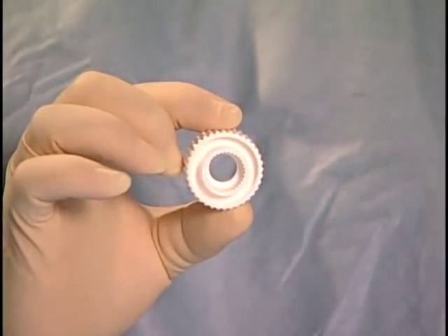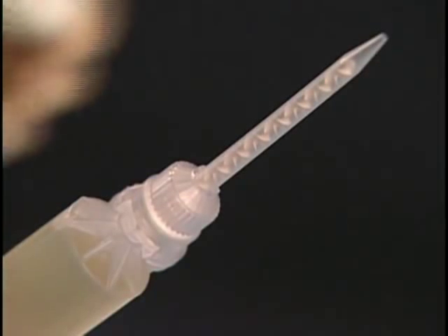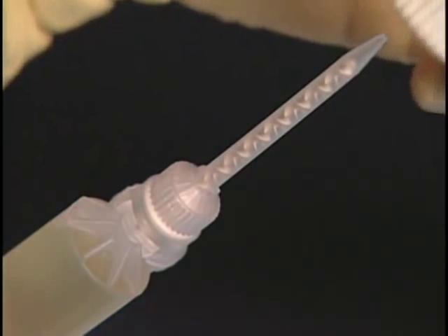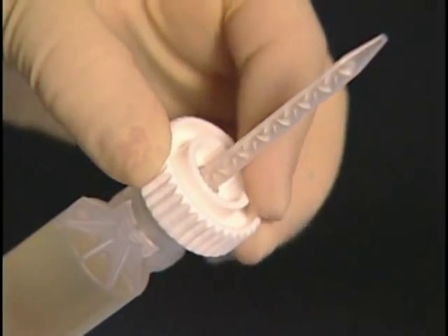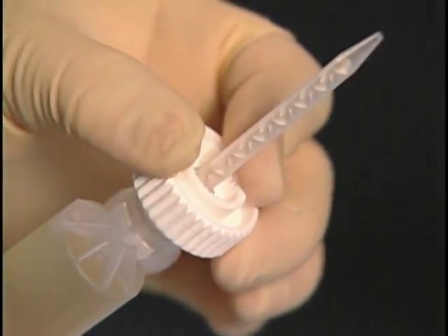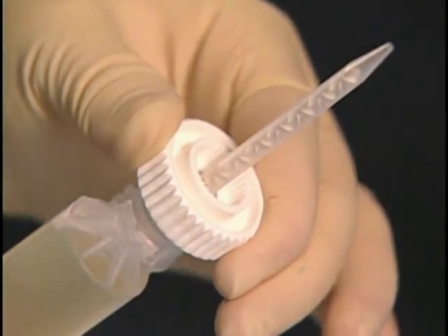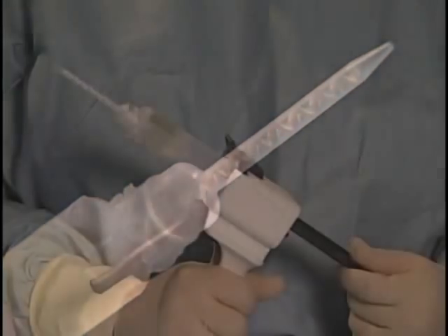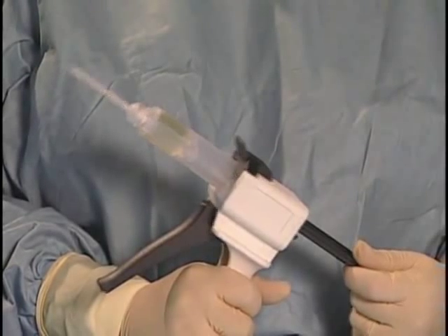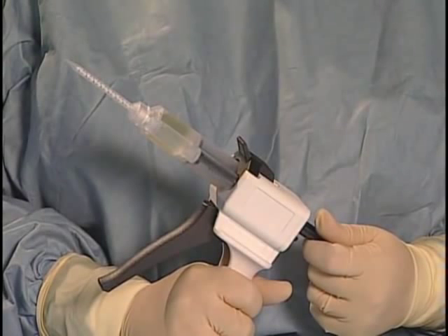If the twist ring tool is used, place it over the applicator tip and slide it firmly onto the applicator tip's rotating collar. Holding the twist ring tool or applicator tip collar, push the applicator tip down firmly onto the cartridge, and then rotate the collar 90 degrees clockwise to lock the tip in place. Gently slide the plunger forward into position until resistance is felt. The assembled adhesive delivery device is now ready for priming and immediate use.